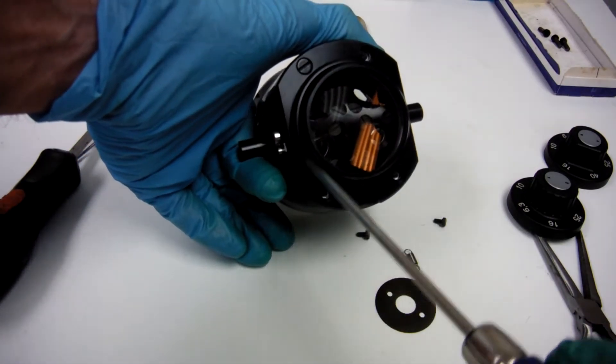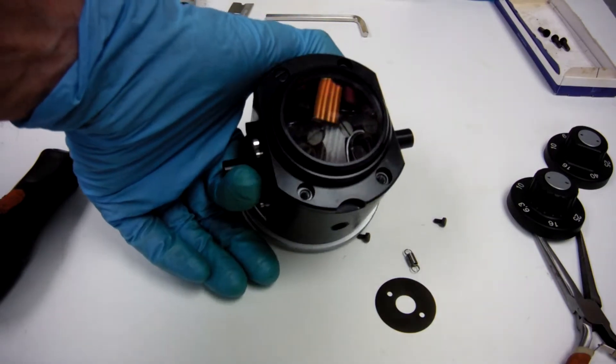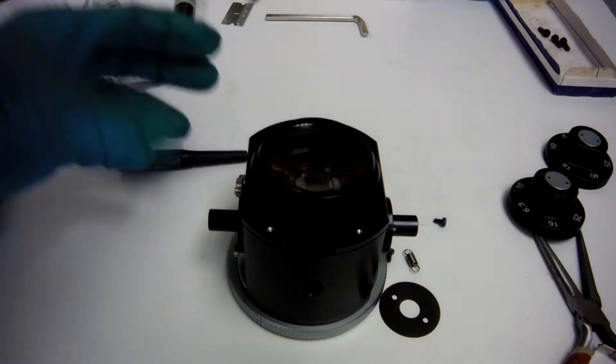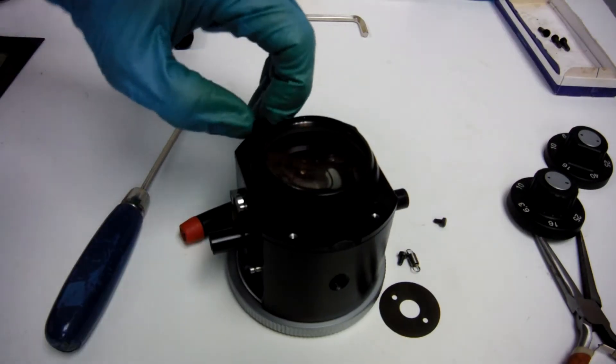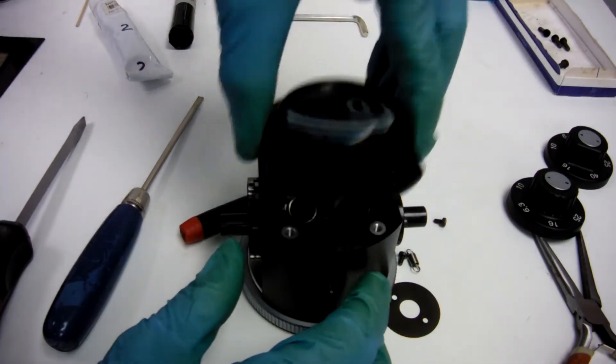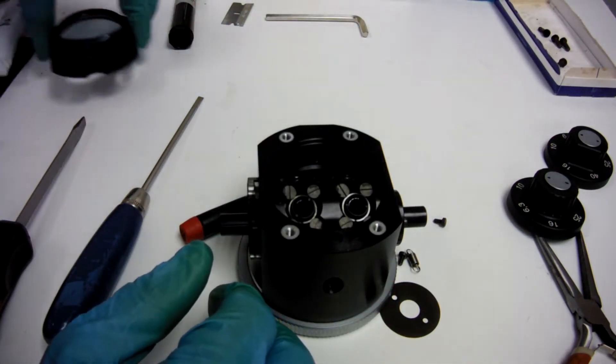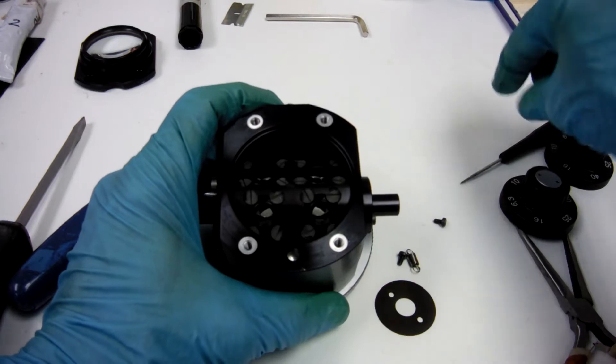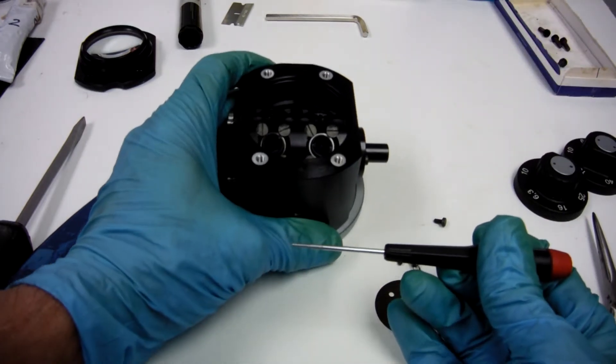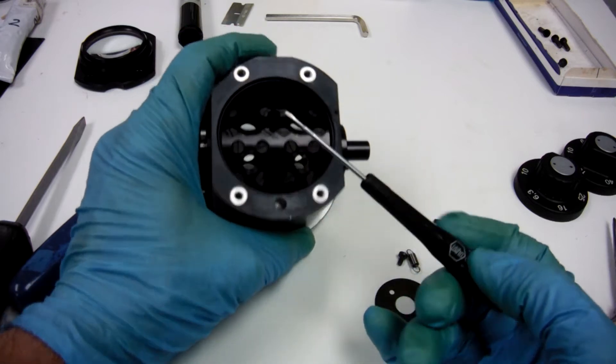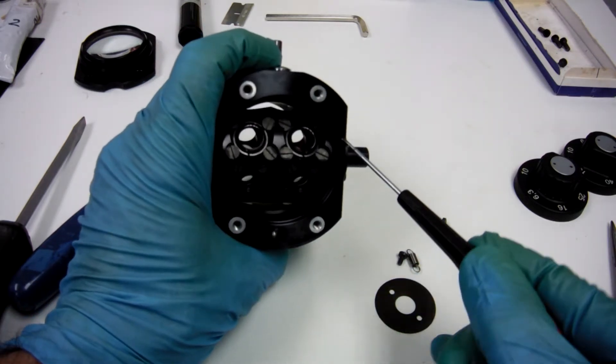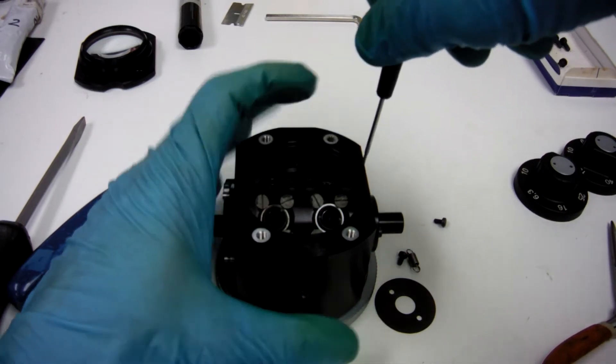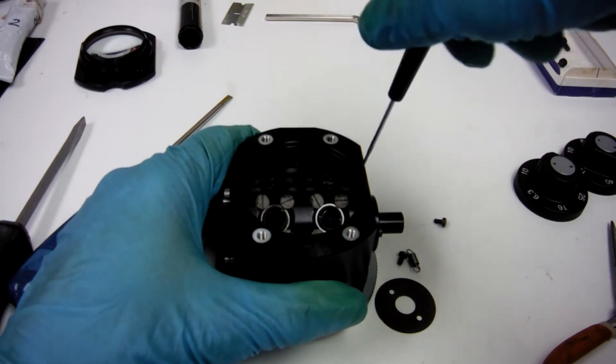There's four screws here. I've already taken three off. I'm going to take the fourth one off. These might be pretty tough. Take this off. Put it to the side. Now, we're going to get our jeweler screwdriver. And right there. Just going to unscrew it until it gets flush with the top. And that'll be sufficient.